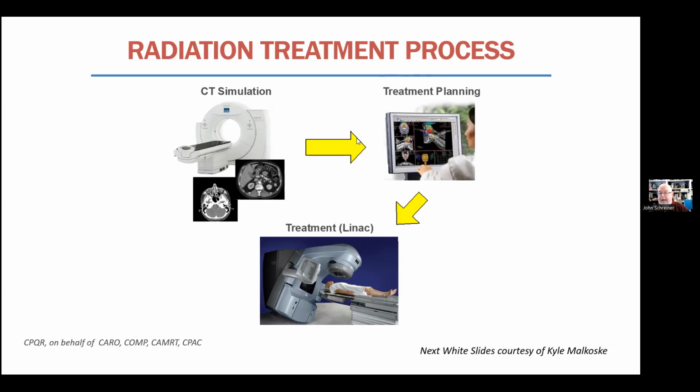And so I can use that same information to, if I had X-rays impinging on the patient, where would the radiation dose go? So this is a really neat kind of tie-in of the physics of the imaging with the treatment planning. So I have this map of how interactions happen that I can now use to say, if I have a radiation beam impinging on the patient, how is it going to give energy into the patient that delivers dose that can treat the disease?